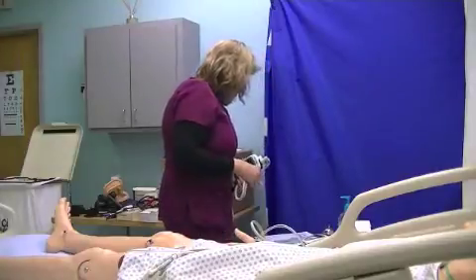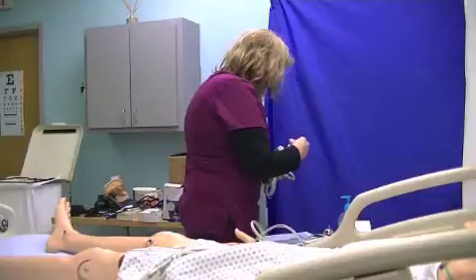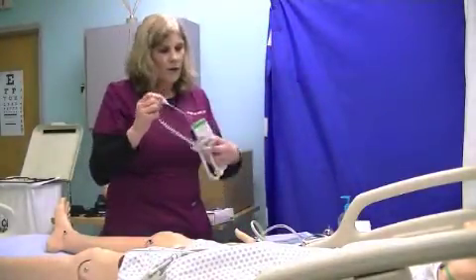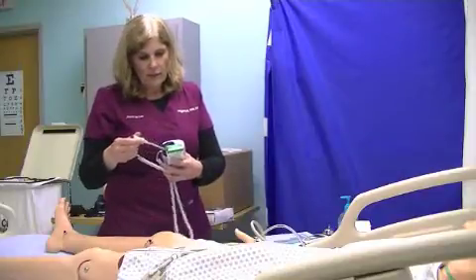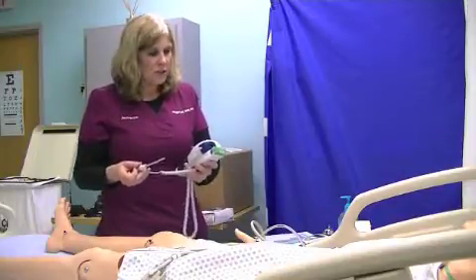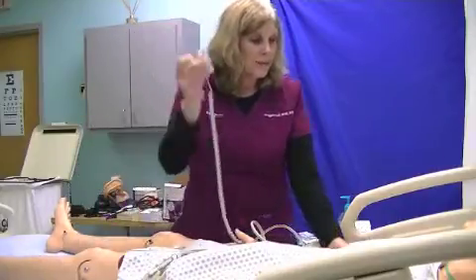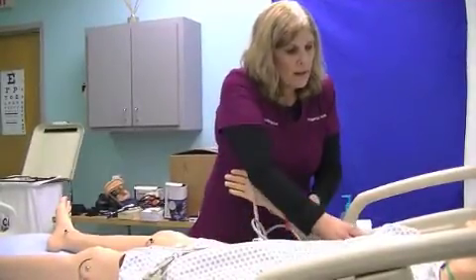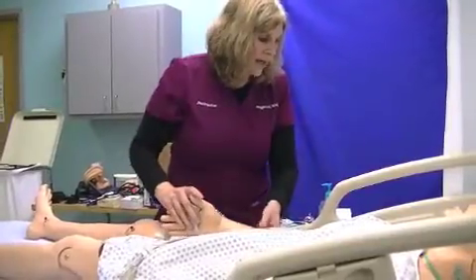So when it beeps. Like I said, if we're doing an axillary temp, we're going to make sure we put a different sheath on. We're going to make sure the axilla is dry. We're going to put this on here. We're going to make sure we change it so the body is flashing. We're going to put the probe facing up toward the patient's head. We're going to lift their arm and put it across the body, and it will go until it actually beeps.